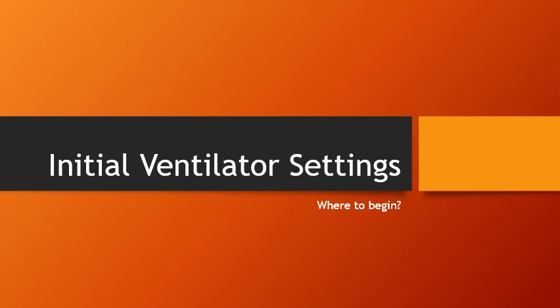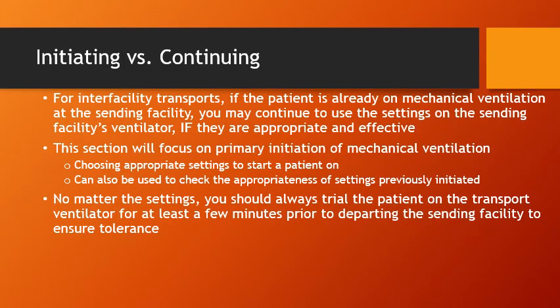started with this section. So the first thing we need to talk about is initiating versus continuing mechanical ventilation. For interfacility transports, meaning you're taking a patient out of one hospital to another hospital, maybe they're in the emergency room at a small rural hospital and you're taking them to the ICU at a bigger hospital, if the patient is already on mechanical ventilation at the sending facility, it's okay to continue to use the settings on the sending facility's ventilator, but only if they are appropriate and effective.